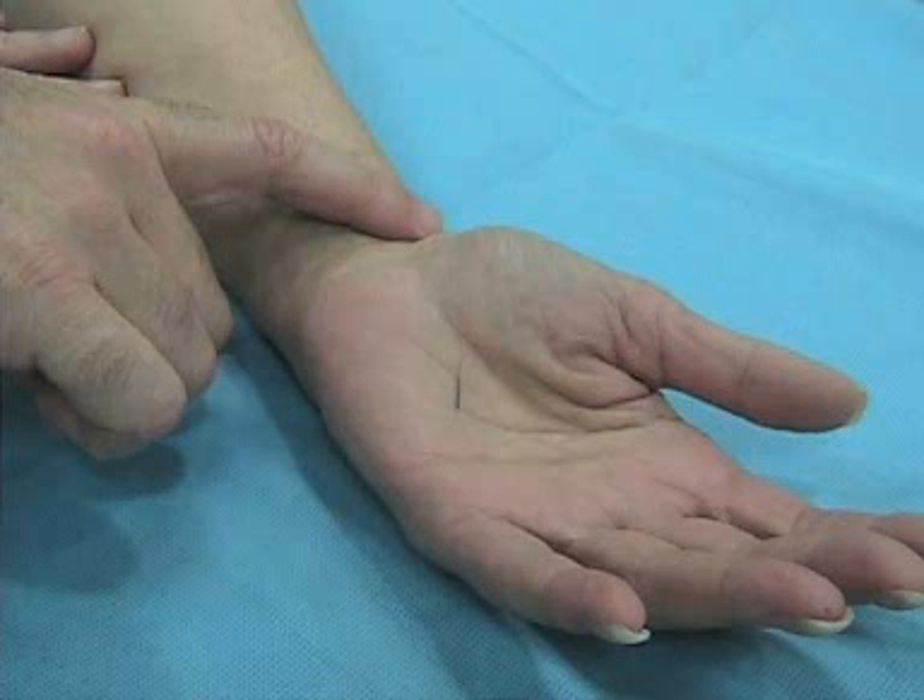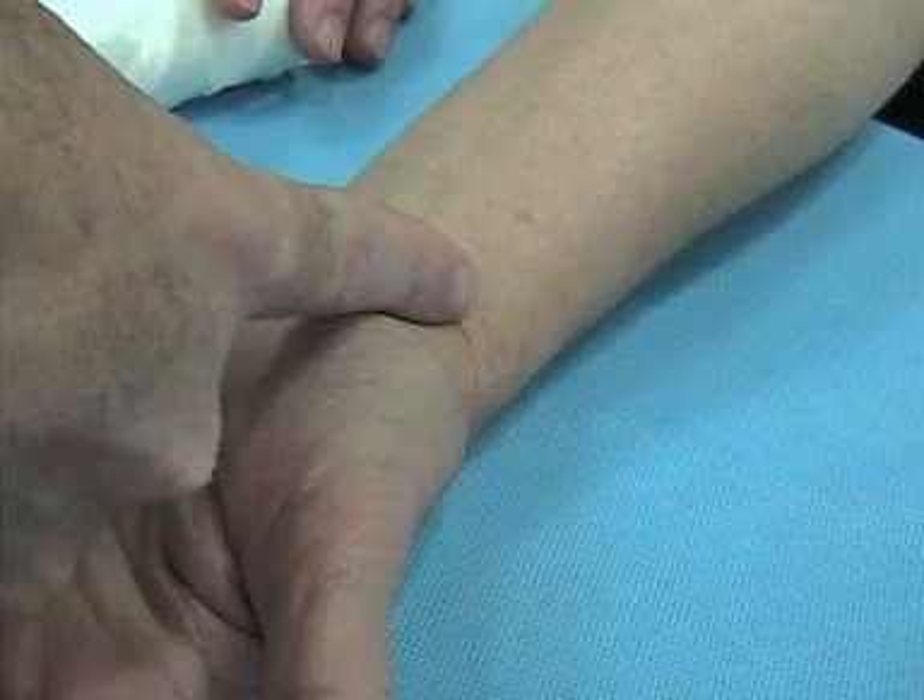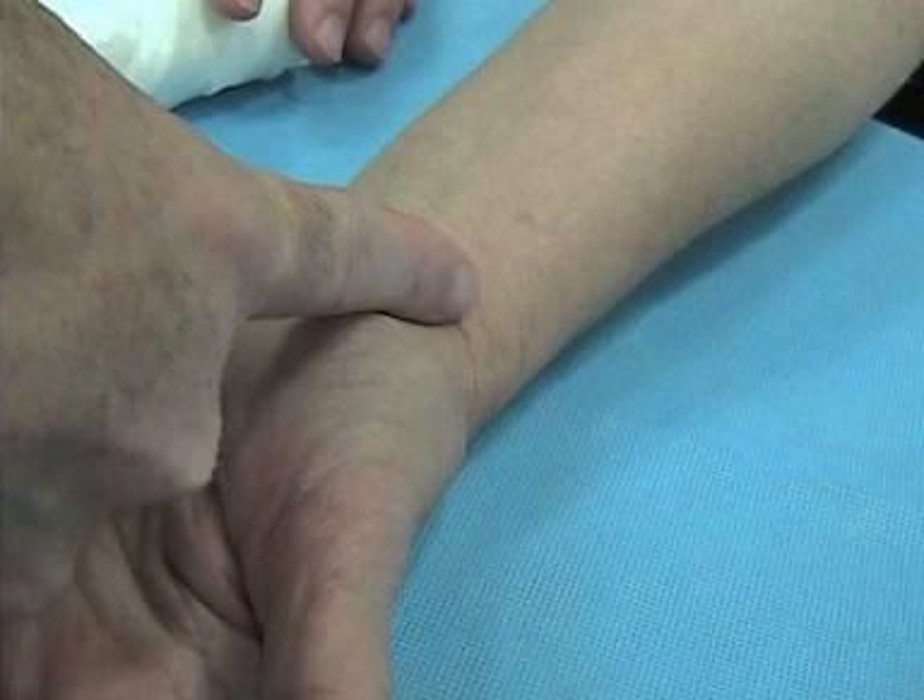It's time to put in the radial art line, which is a common procedure for cardiac cases and many others. You can see my finger pointing to where the art line goes — note the thenar eminence by the thumb. You really want to crank the wrist back, because trying to have a needle go up and over that thenar eminence and into the artery is going to be a problem.